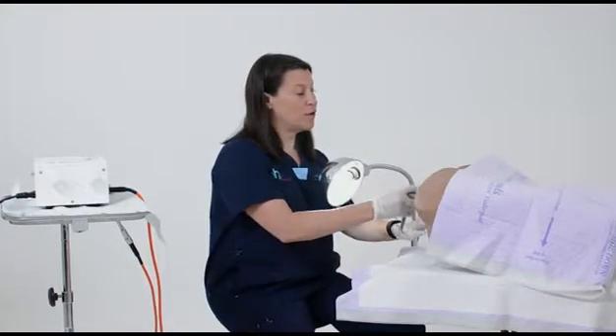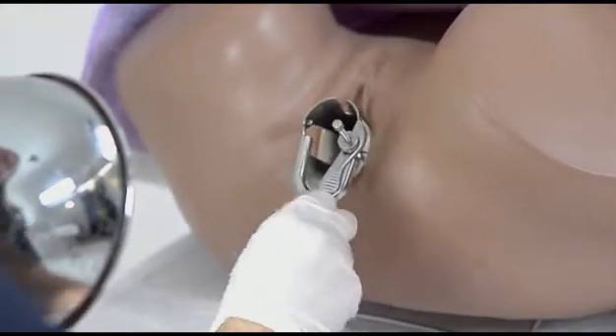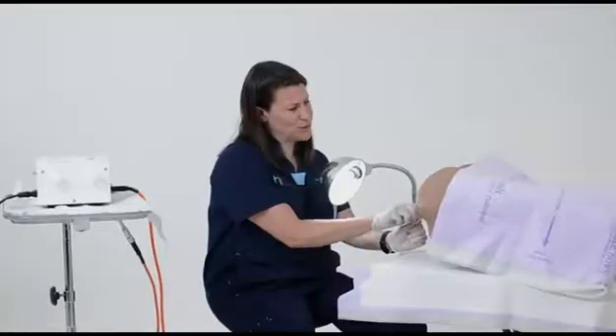So next, I'm going to put in the speculum and open it up. I like to open it all the way, and sometimes I use a slightly larger speculum to be able to visualize really well.